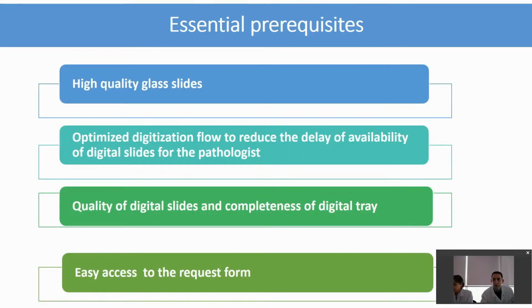However, we can only take full advantage of these benefits if these essential prerequisites are met: high-quality glass slides, optimized digitization flow to reduce the delay of availability of digital slides for the pathologist, high quality of digital slides without blurring and missing areas, completeness of the digital tray, and easy access to the request form for the pathologist.